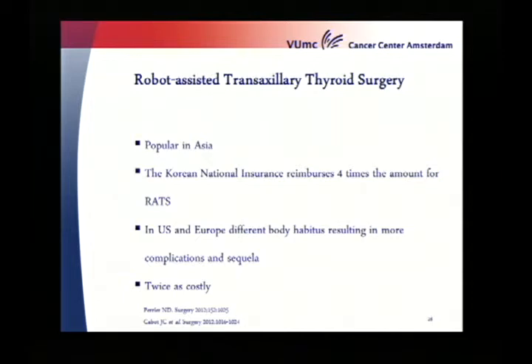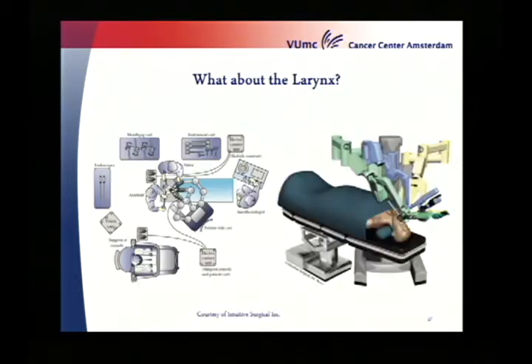What about thyroid surgery? It's very popular in Asia, and in Korea, you are reimbursed 4 times the amount if you do it transaxillary as compared to the open approach. But in the US and Europe, patients usually have a different body habitus, resulting in more complications and sequelae, and it's twice as costly. And one of the surgeons from MD Anderson, Nancy Perrier, tried the robot for this indication, but abandoned it because of all these complications and the cost. So there's another argument down the drain.